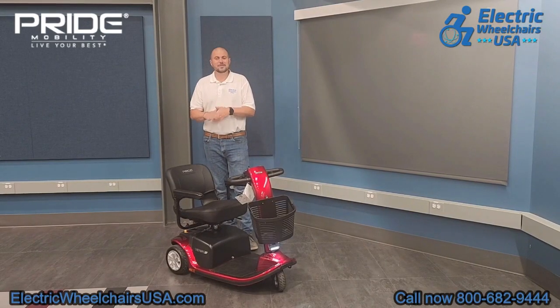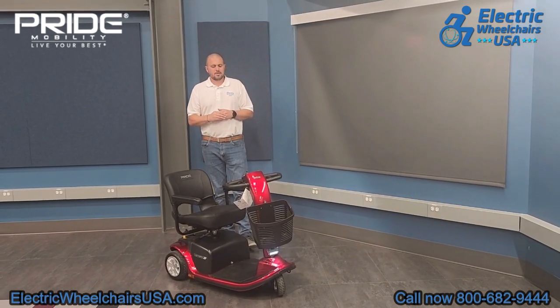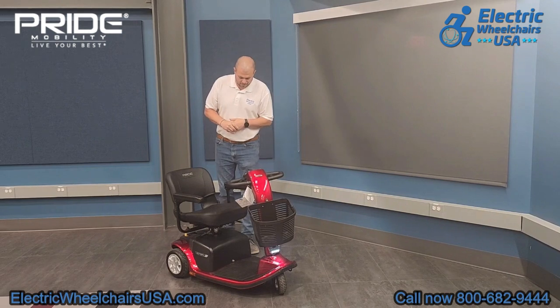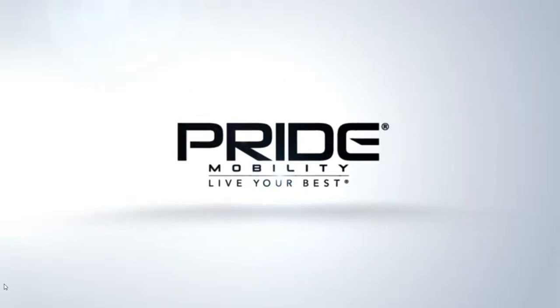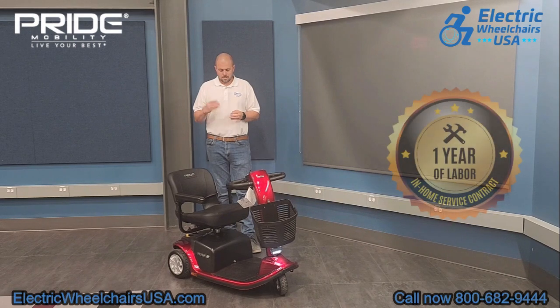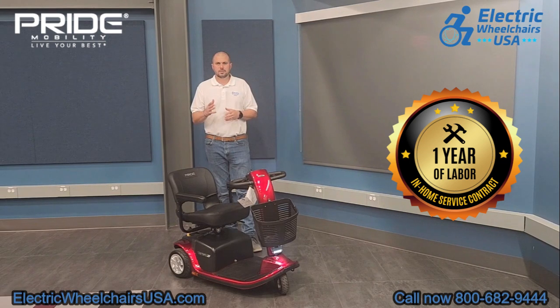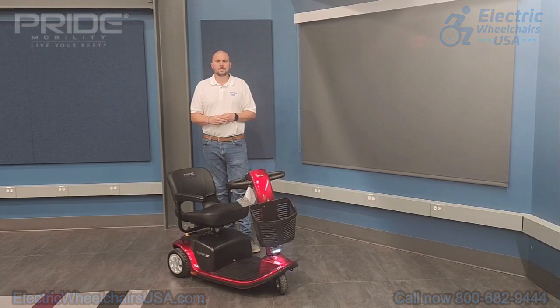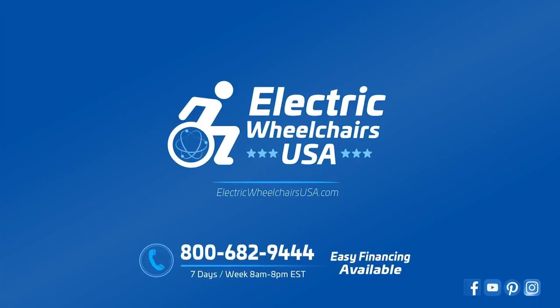In conclusion, if you're looking for a great three-wheel mobility scooter with a very comfortable seat, great turning radius, and the ability to handle outdoor terrain easily, the Victory 9 three-wheel is a great option. We love working with Pride Mobility — they're one of the best brands in the mobility industry and have one of the best warranties, which includes one year of in-home service. As long as it's a warranty-approved claim, they will dispatch a technician to your home to diagnose and resolve any issue within the first year. If you have any questions, feel free to call us at 1-800-682-9444 or visit electricwheelchairsusa.com.